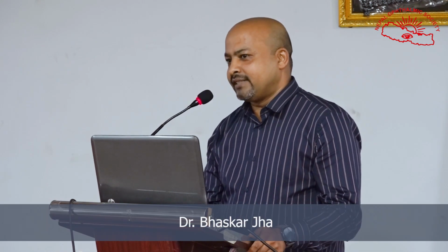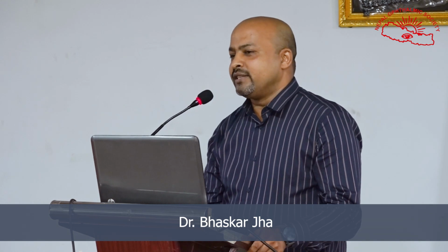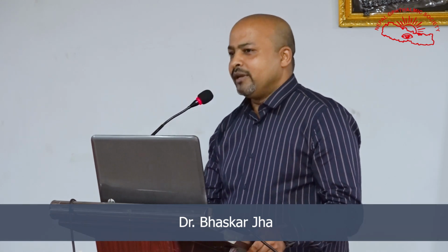Cataract surgery these days is less of a rehabilitation and more of a refractive surgery because most of the patients have a higher requirement of intermediate vision, and we also call them premium IOLs. And premium IOLs are mostly required by patients for the intermediate vision or quality of vision because of the use of digital devices. So both cataracts and glaucoma are conditions that increase with age.